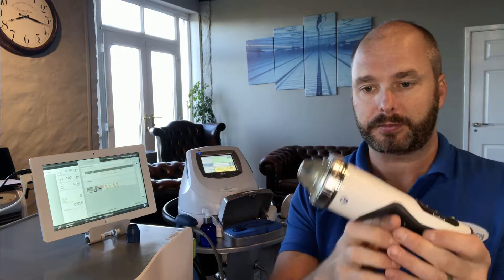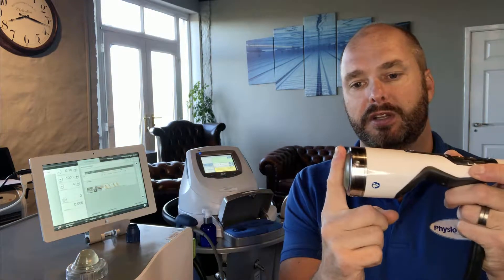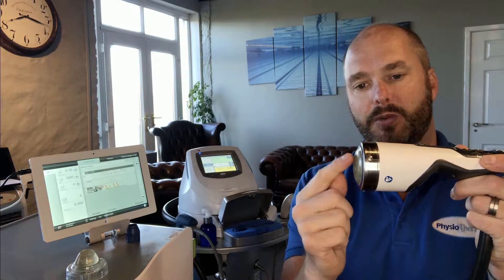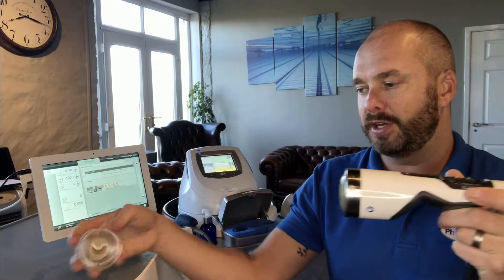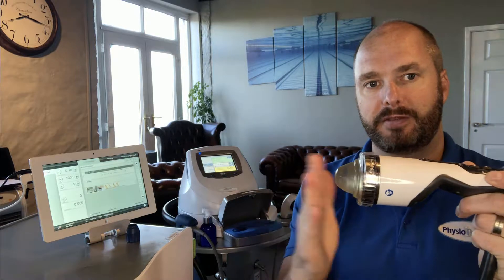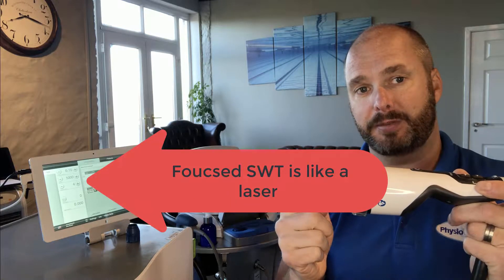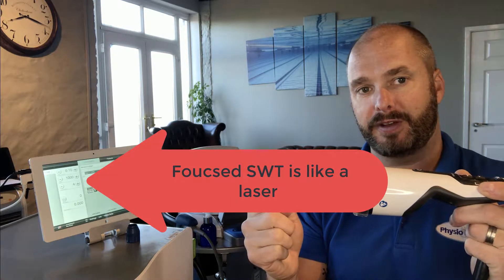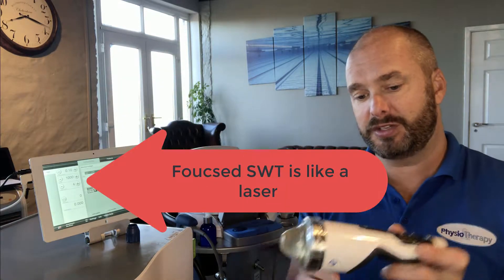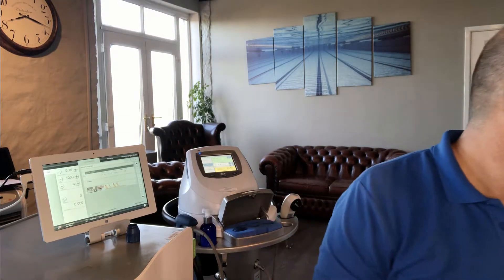Now focused shockwave uses a standoff. The focus of the shockwave is always about the same distance away from the applicator, so the reason we put a different standoff on is simply to move the machine further away from the skin contact. In effect this is like a laser pointer — a very specific treatment point — and if I tilt the head, the treatment area changes dramatically.